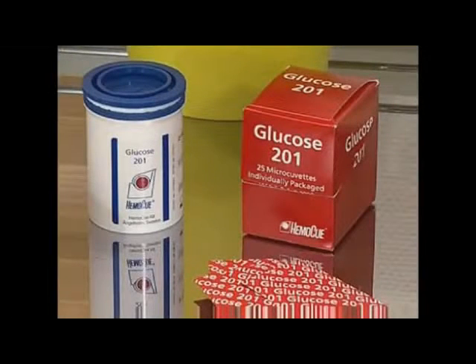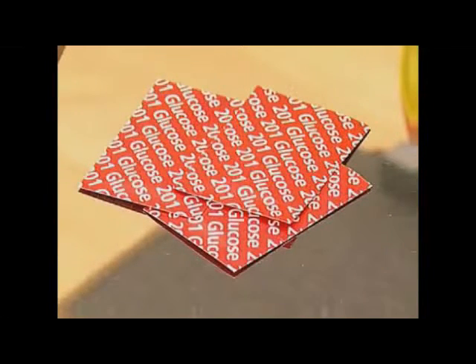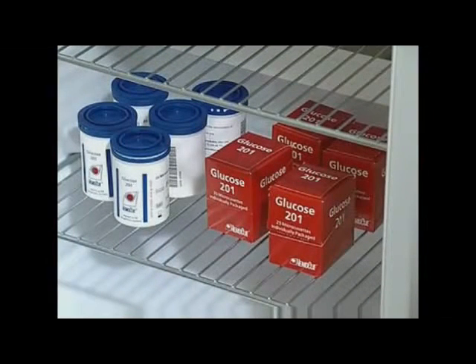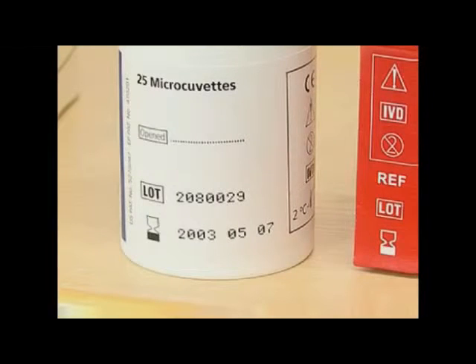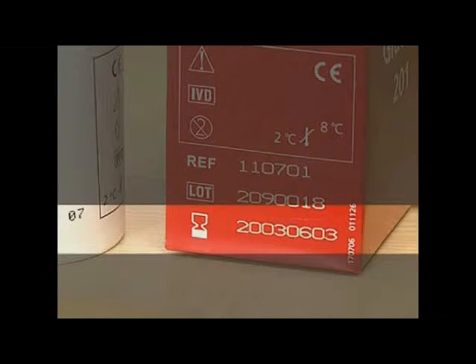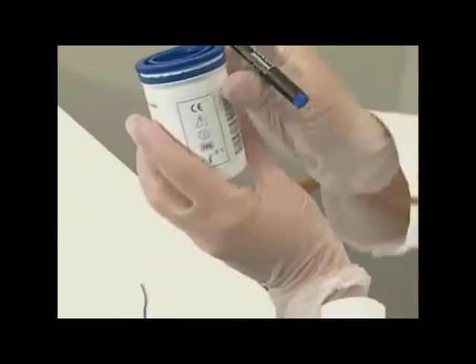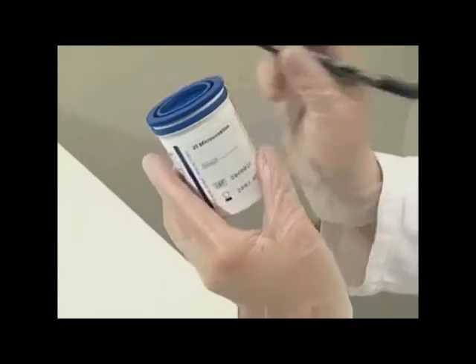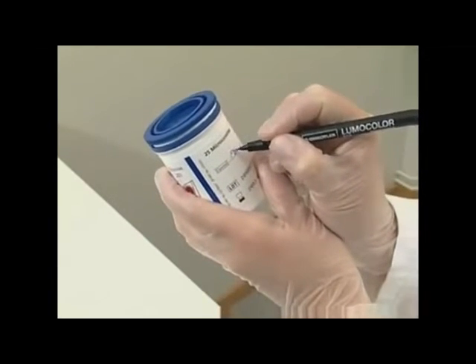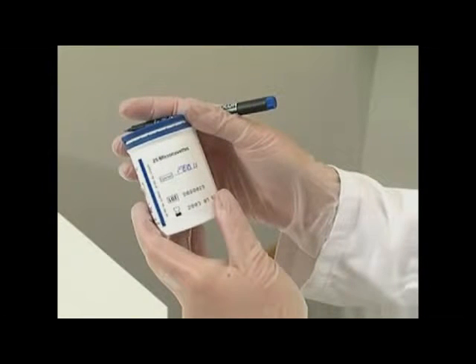The micro cuvettes are available in vials or individual packages. Store the micro cuvettes in a refrigerator and use them prior to their expiry date, which is printed on each package. Once the seal is broken, the micro cuvettes are stable for 30 days when stored in a refrigerator, or 3 days at room temperature. Always keep the vial properly closed, and it is recommended that the date of opening be written on the vial.